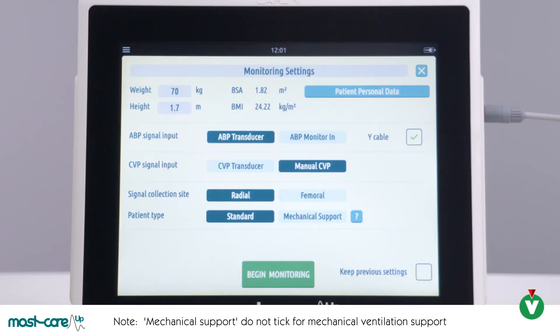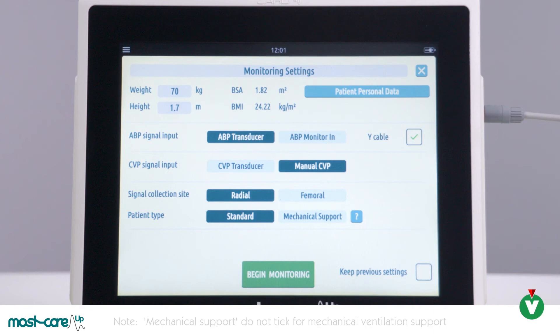If you have not done so already, please now connect your Y cable to your arterial cable and patient monitor cable. Then press Begin Monitoring.